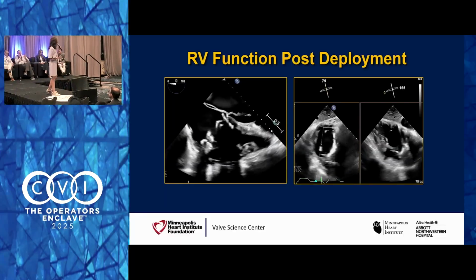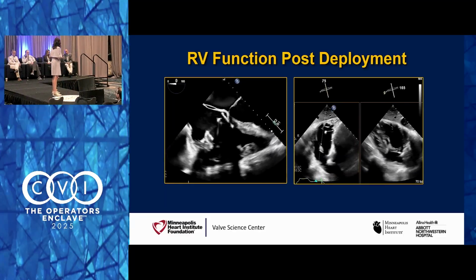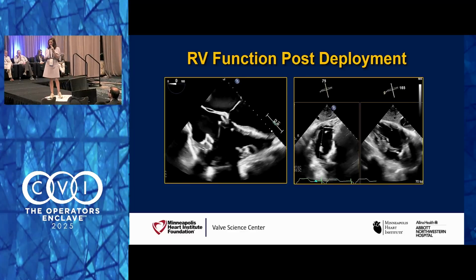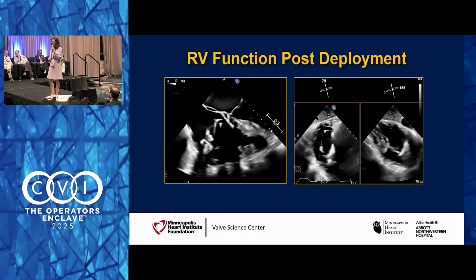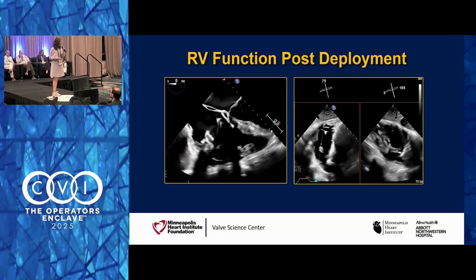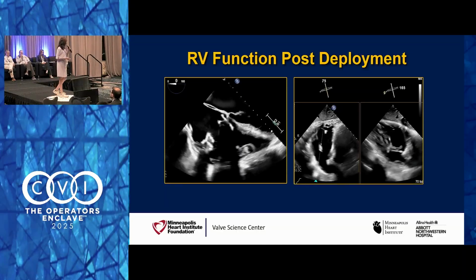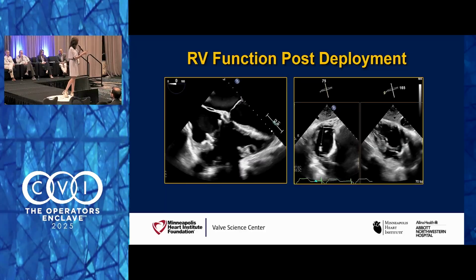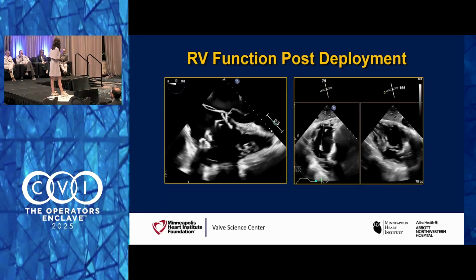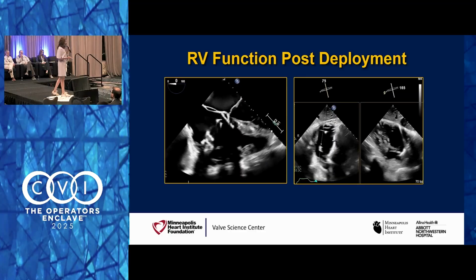And I said, the RV is dead. Look at this. We checked with our anesthesia, hemodynamics. She's actually doing pretty well. There were not many pressures. I was pleasantly surprised. I was nervous looking at this on echo, and we said, let's just wait. Let's wait and see, right, Paul?